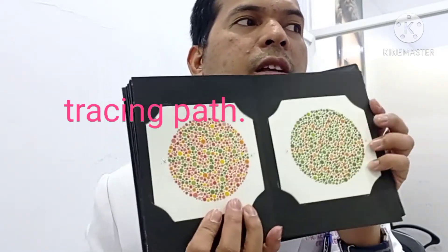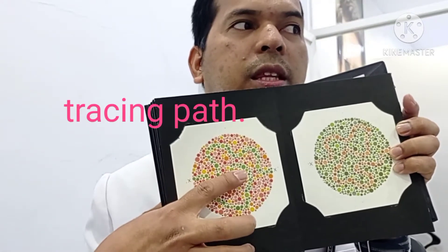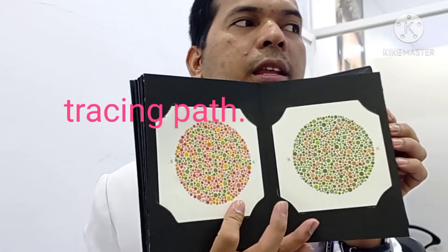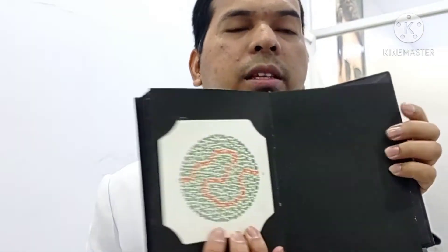Number? There's none. This one here — trace it. Green path. And the other one. And this one. And this one. The last one — this is 24 plates. A very simple and reliable tool for us to test color deficiency here in the clinic.